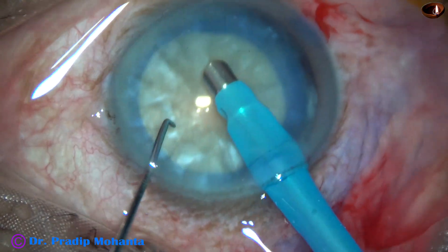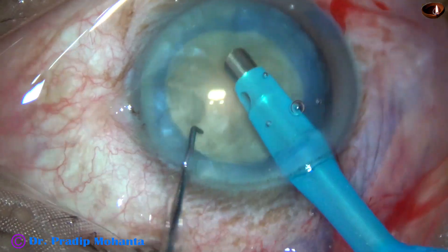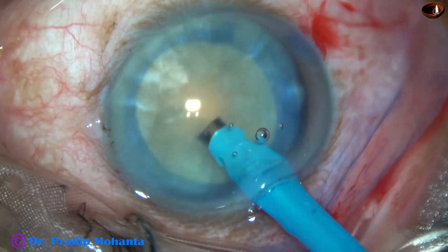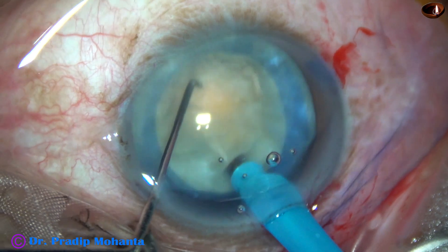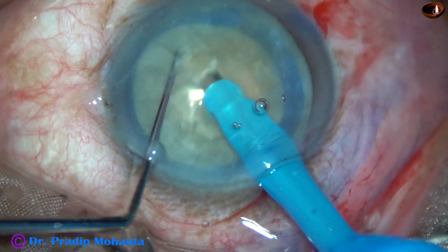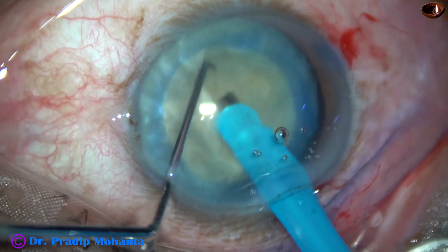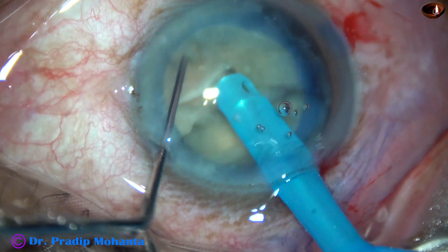The handpiece goes in, bevel down, and some superficial cortical matter is removed. Now I am going to divide the nucleus by direct chop. The tip is buried into the substance of the nucleus, goes through the nucleus for a distance, and then the chopper is used to make a nice crack. Rotate it 180 degrees, hold at another place, and the nucleus has divided completely into two hemi-nuclei.